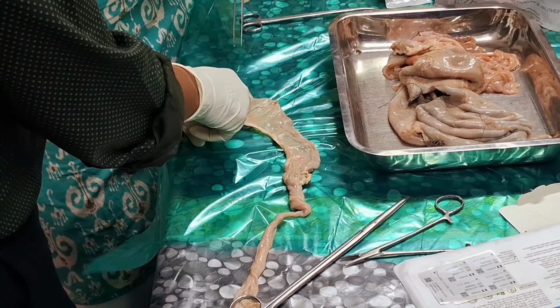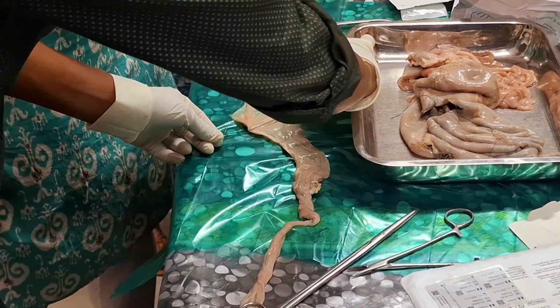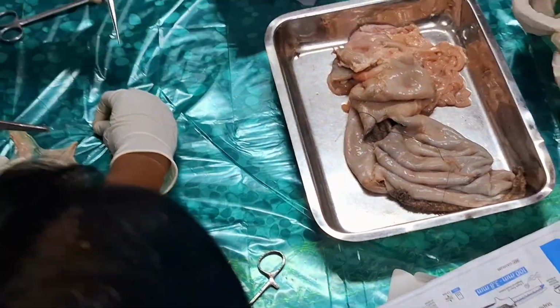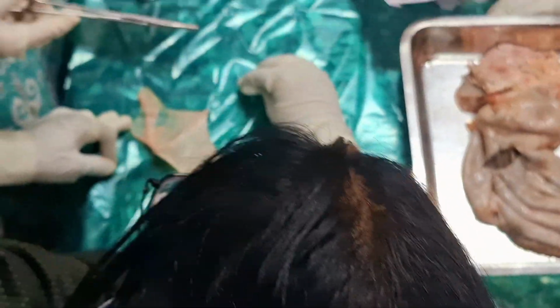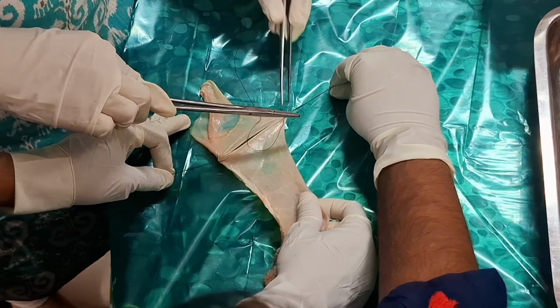Take the first layer, that is the Lembert stitch. The direction should be perpendicular to the cut edge.